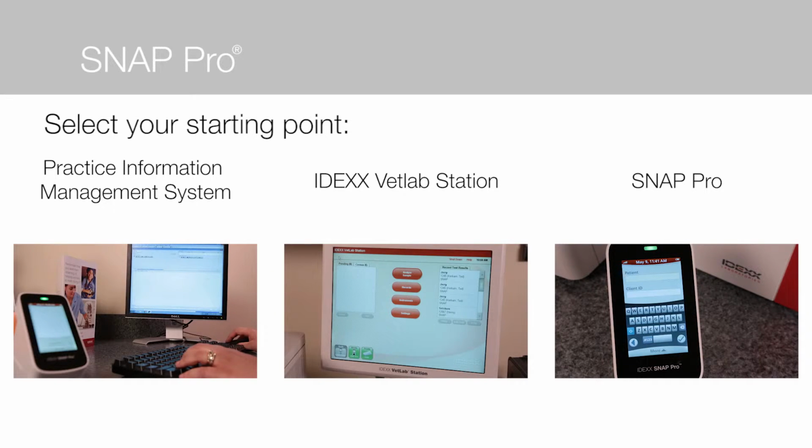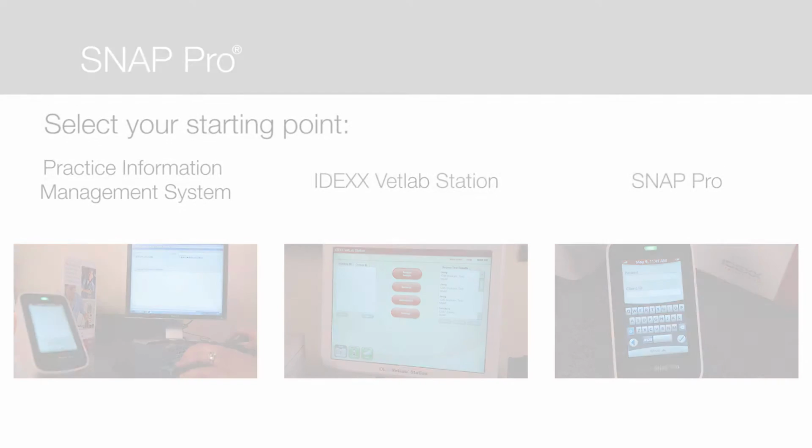Let's look at each of the 3 ways to help determine the best workflow for your practice. A best practice tip is to start your Snap request from the point where you would like to have the final Snap test results stored.